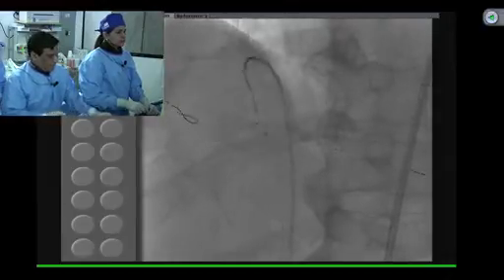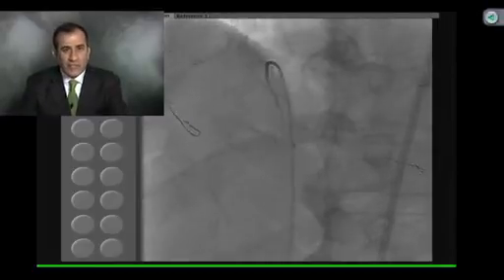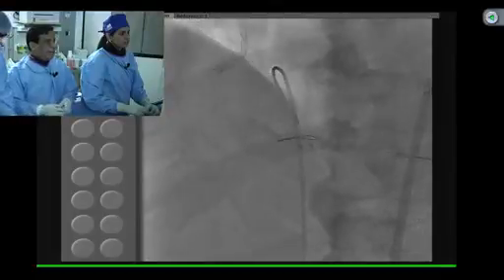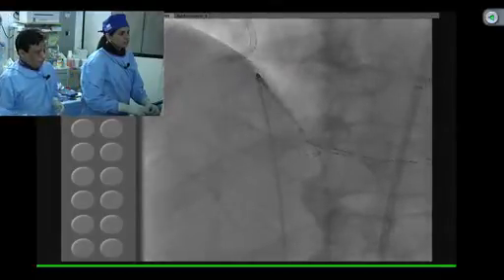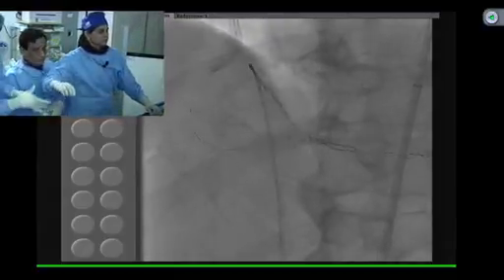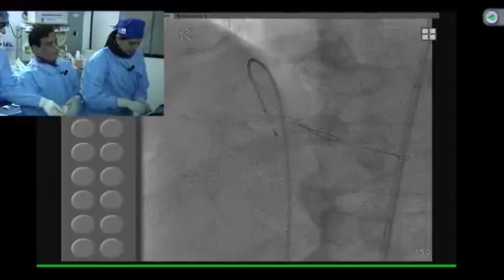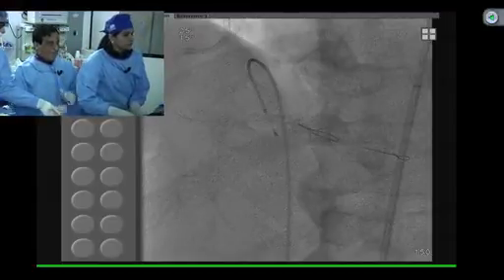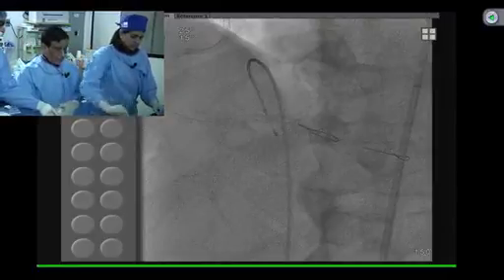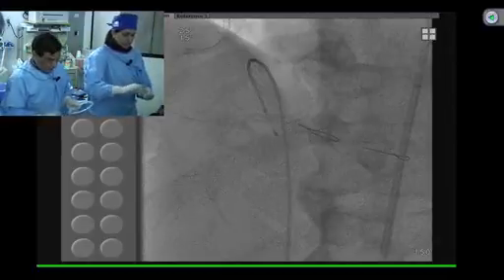More questions from the audience. Do you have both the Volcano and the Boston Scientific IVUS, and where are you using those individually? Yeah, I think one of the advantages of the Volcano is the virtual histology point of view, but from our point of view, it's very simple. We have 6 cath labs. One of them is with the pediatrics. So the other 5 labs we have fixed systems. In 3 rooms we have the iLab, and in 2 rooms we have Volcano, and both rotational as well as the old device available for Volcano.